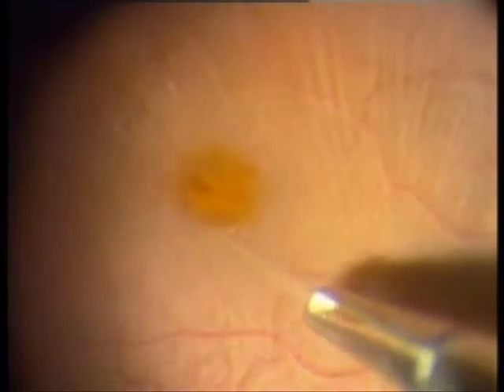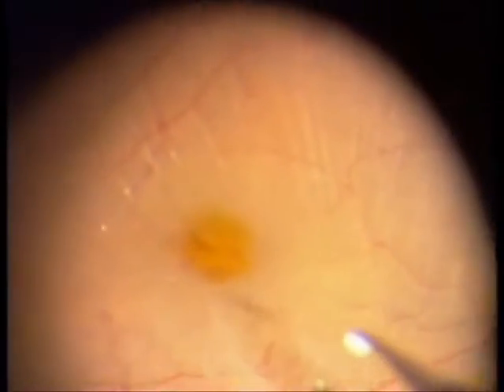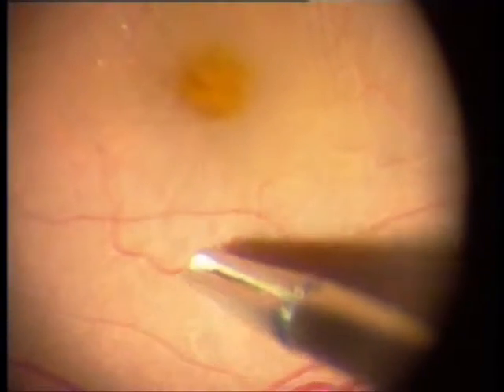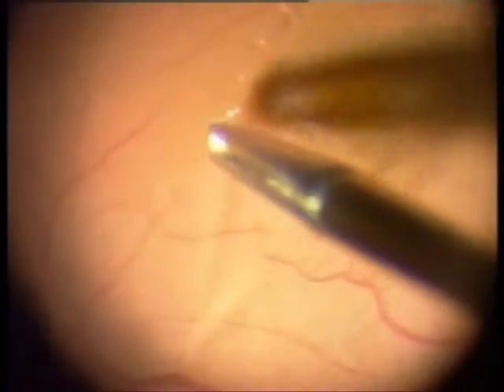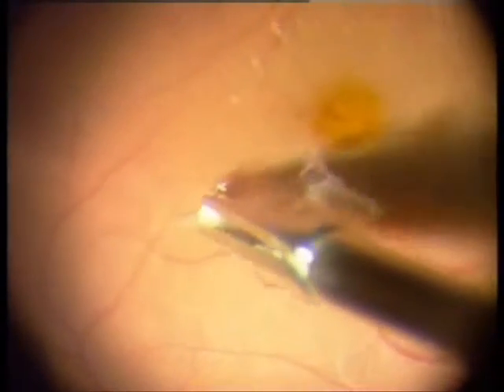We grasp the edge of the membrane using a fine forceps and start a tangential movement holding the edges. The fine stria created by the membrane are visible quite clearly. The membrane peels off quite easily without much traction on the underlying retina.